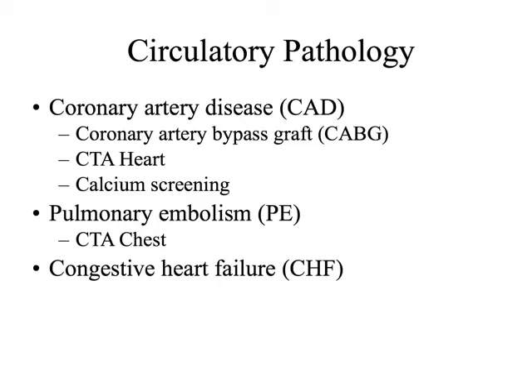Another big important one for us in CT is a PE study. So we're looking for a pulmonary embolism. This is a significant test and is related somewhat to the VQ scan from Nuke Med. But PE, there's at least 100,000 cases of PE every year in the United States, and if it's untreated, it's associated with about a 30% death rate.